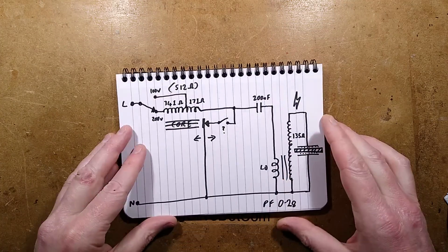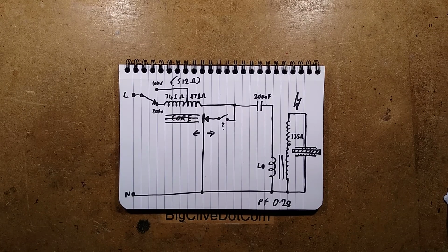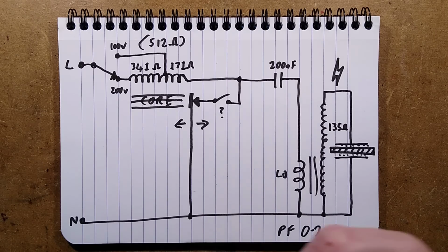I'll put that down there and bring in the schematic. And I shall focus down onto that. And then I shall lock that and zoom in so we can take a closer look at the circuitry. It's very simple, as stuff like this tended to be, because, well, it was the early days of electricity.